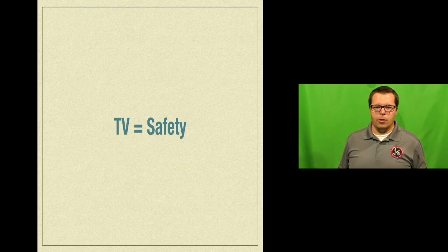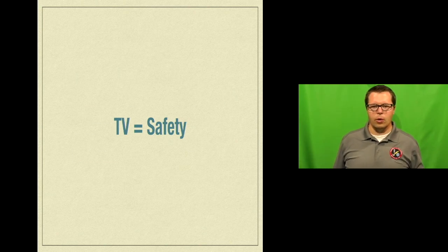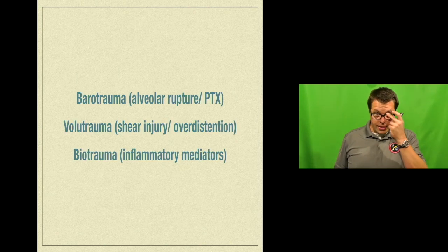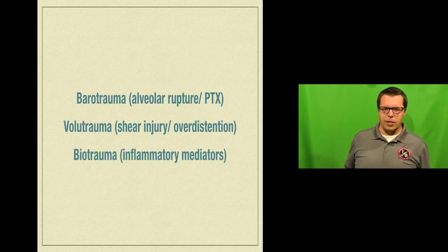We set tidal volume as a safety parameter mostly. This is one that we are mostly going to set and then leave alone because we don't want to mess around with it a whole lot. The reason why is that tidal volume appears to have a big effect on how well the patient's lungs handle this weird type of ventilation.